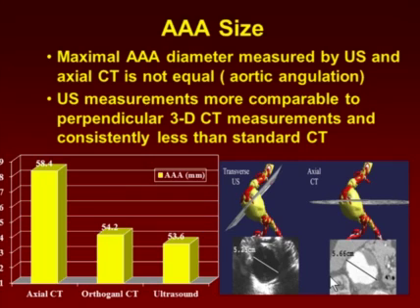So a study was done at the institution where I was working in Norfolk, Eastern Virginia Medical School, and that study was published in the European Journal of Vascular Surgery. I'll give you that in a moment. But the important thing is that we compared the ultrasound measurements to 3D reconstruction CT scans in which a perpendicular line could be mechanically dropped in and measured, and then compared that to axial CT.